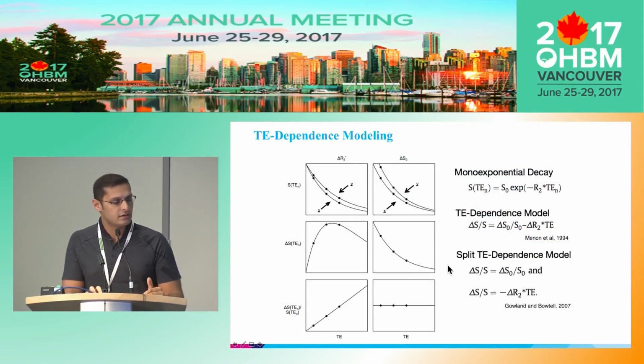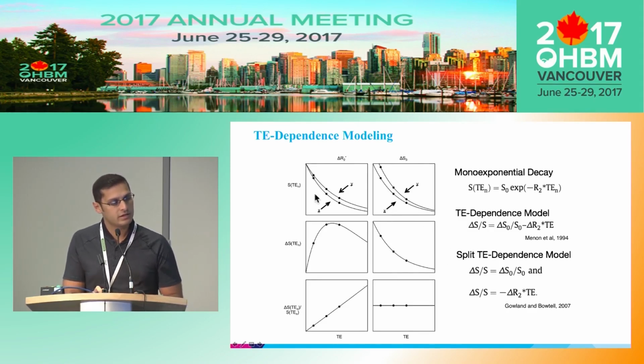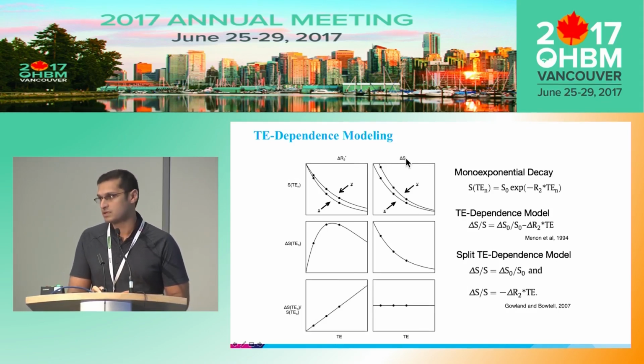The idea of multi-echo fMRI is to take this T2 star information and utilize it to its maximum ability. So I'm going to go through these boxes, starting at the top left here. Each column represents a type of change. There's essentially two parameters that are changing fundamentally during your fMRI experiment. One is your decay rate, basically the change in your magnetic susceptibility in your voxels. Another is the initial intensity, also called the proton density. It's the amount of stuff in a voxel.